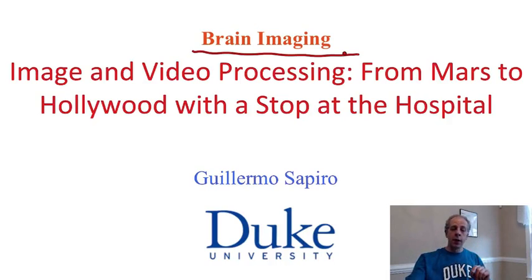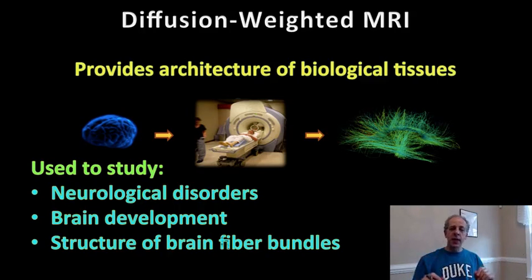We are going to start with a bit of a discussion on a relatively new modality which is called diffusion-weighted MRI, diffusion-weighted magnetic resonance imaging. MRI is very old and it has been a tremendous contribution to medicine. Diffusion-weighted MRI is, as I say, a relatively new technique.